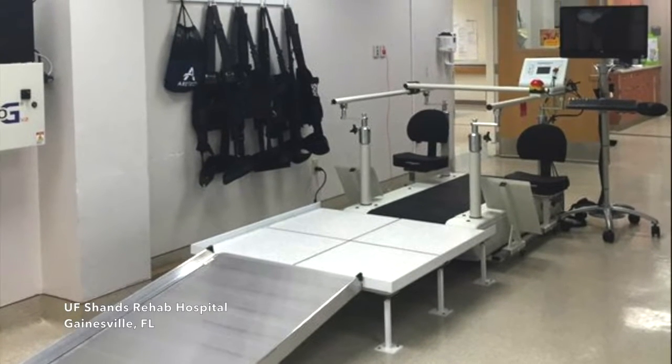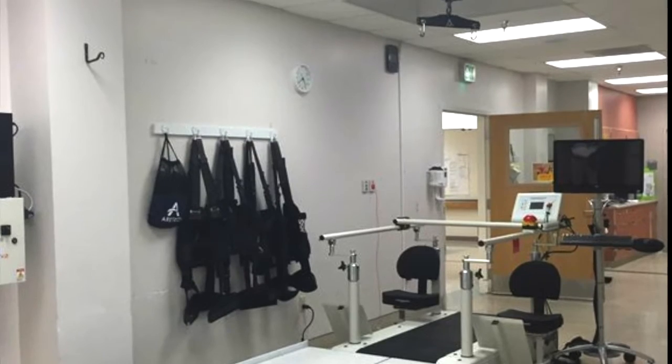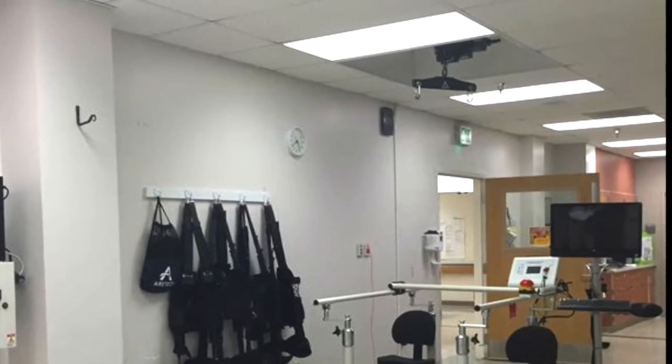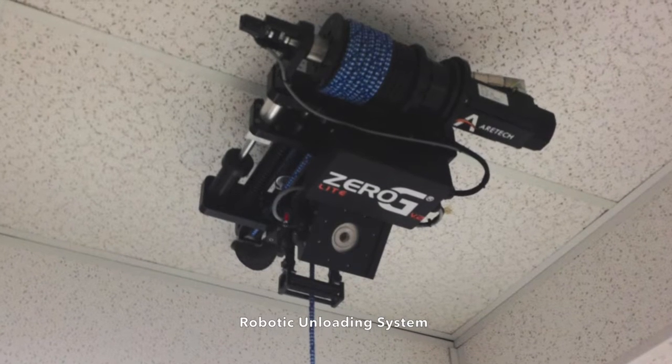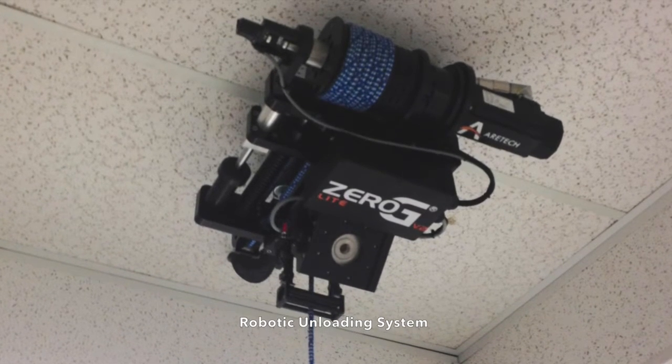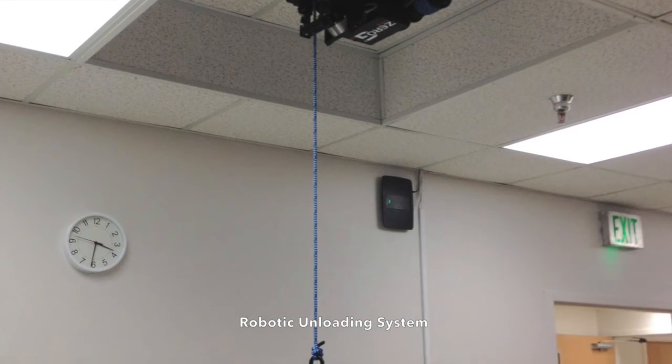Aretech Zero-G Lite is a robotic bodyweight support treadmill system which provides dynamic bodyweight support and fall protection. The robotic unloading system provides precise bodyweight support and is integrated with a Woodway treadmill creating one harmonious system.